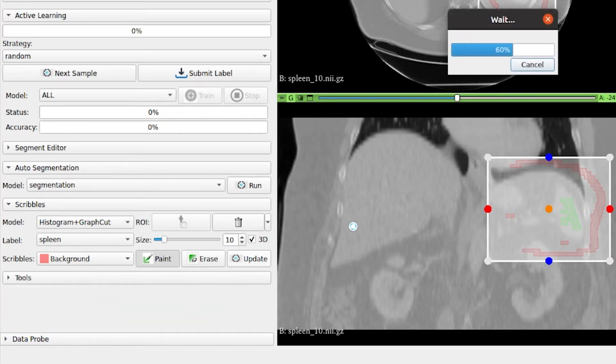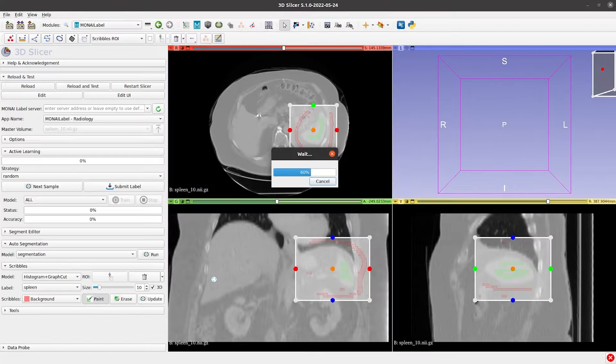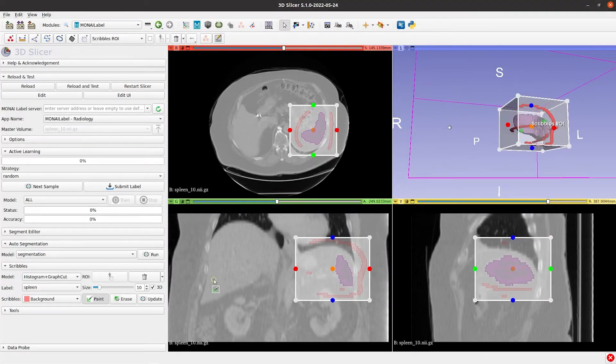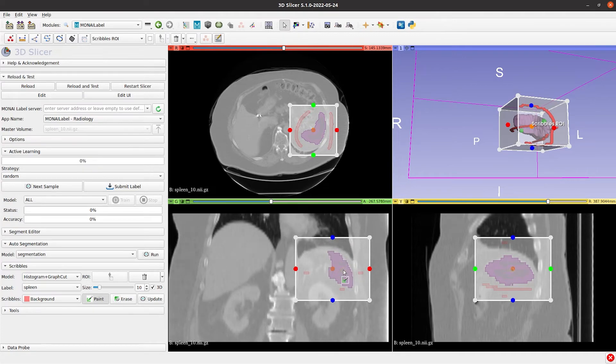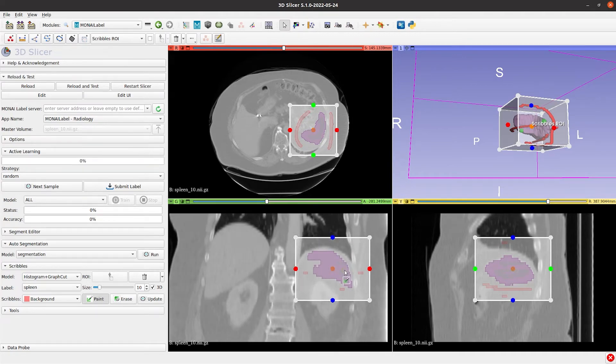Depending on the computer, this may take 20 to 30 seconds. We can add more Scribbles to refine the segmentation. Otherwise, we move to the next label.